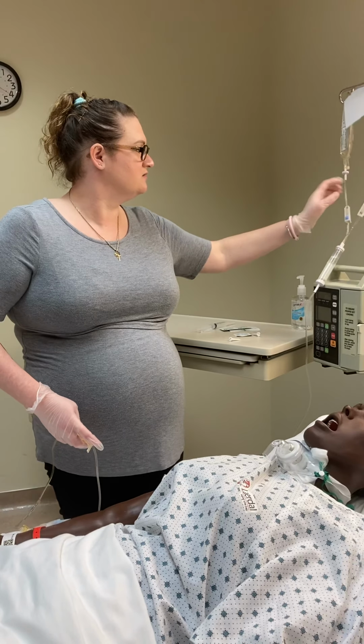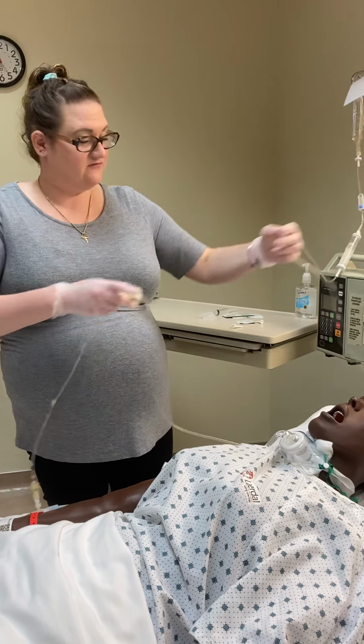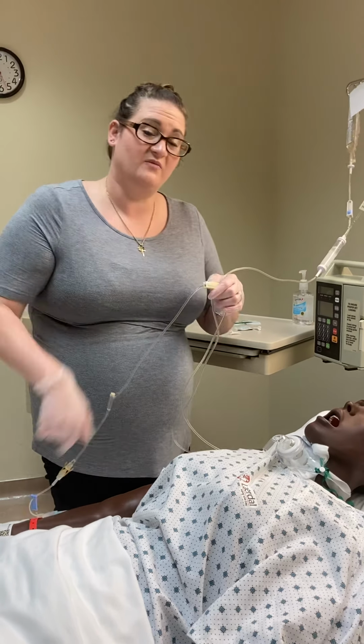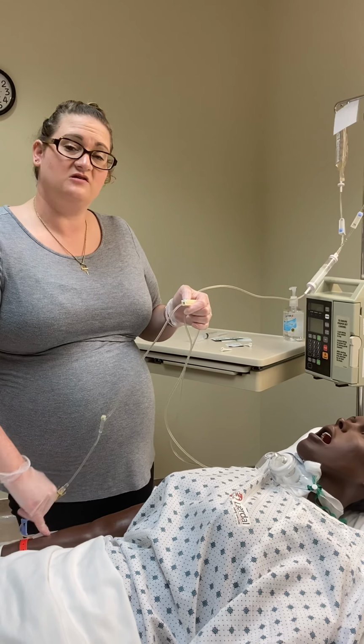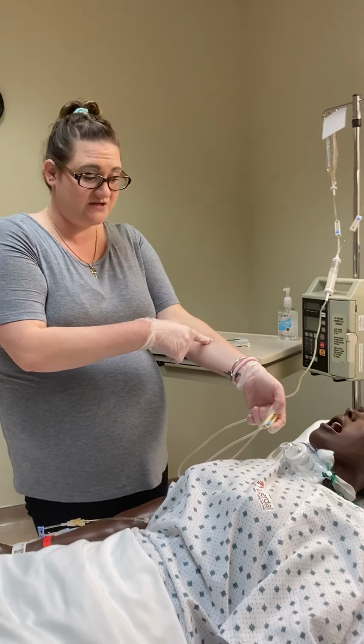The first 15 minutes are the most important. We can't leave the patient. We have to be with them at the bedside. The first 15 minutes are when your acute reactions are going to occur. So I'm going to regulate this. Now my timing for my 5 minutes cannot start until the patient is actually getting the blood into their arm.